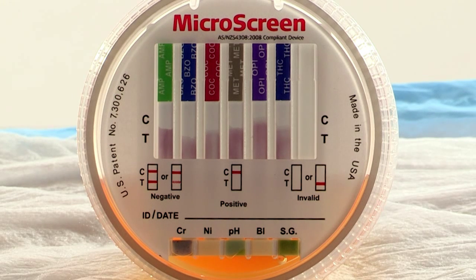The testing process will take approximately 2 to 3 minutes, and what we are looking for is lines turning up all across the C zones, which are the control zones, and where the lines are turning up across the T zone. So we can see the urine now moving up steadily, and you can actually see lines starting to appear.